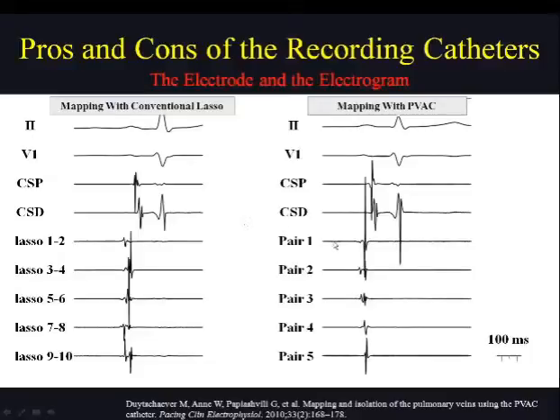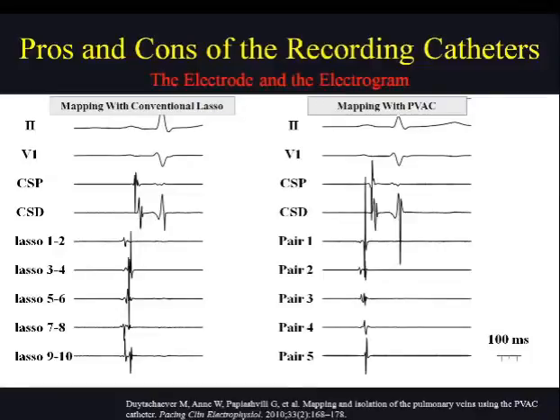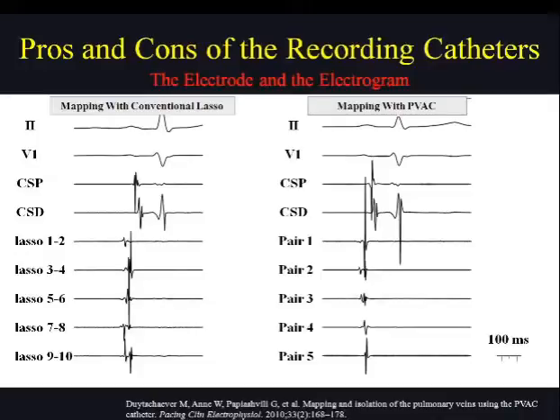We always use the PVAC recordings in a set of 5 pairs. The recording system is a BART EP system with a gain of 16. Filter settings are high-pass 100 Hz to low-pass 500 Hz. You can appreciate the far-field potential and the sharp PV potential, just like a conventional circular mapping catheter recording.